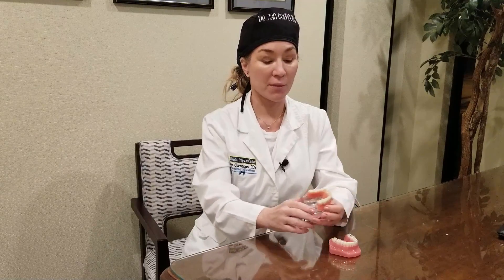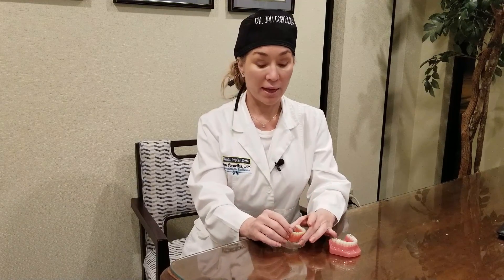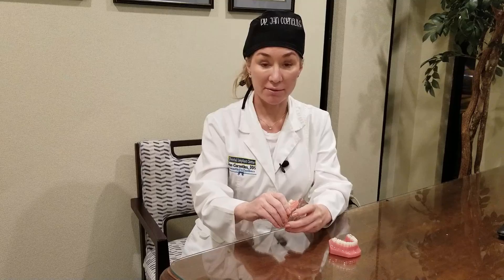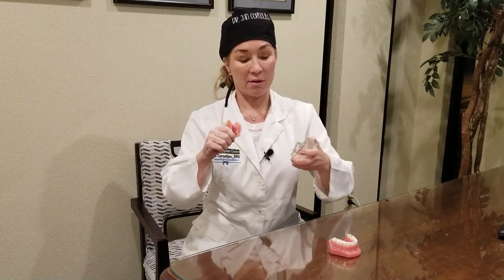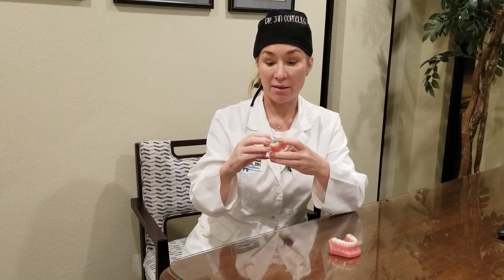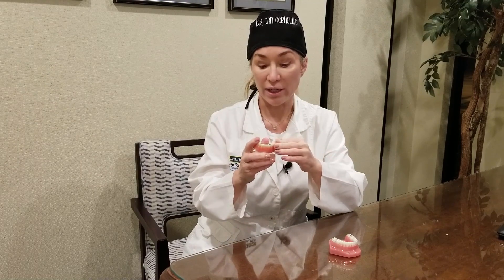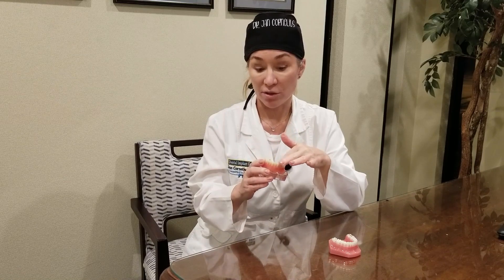After the implants are placed, we start making the teeth. The teeth can initially just be snapped in — we put little snaps on the implants and snaps on the inside of a denture, and the snaps retain your teeth. They snap right in, providing support and stability against rocking, making them very, very good. Some people like this so much they just stop there.